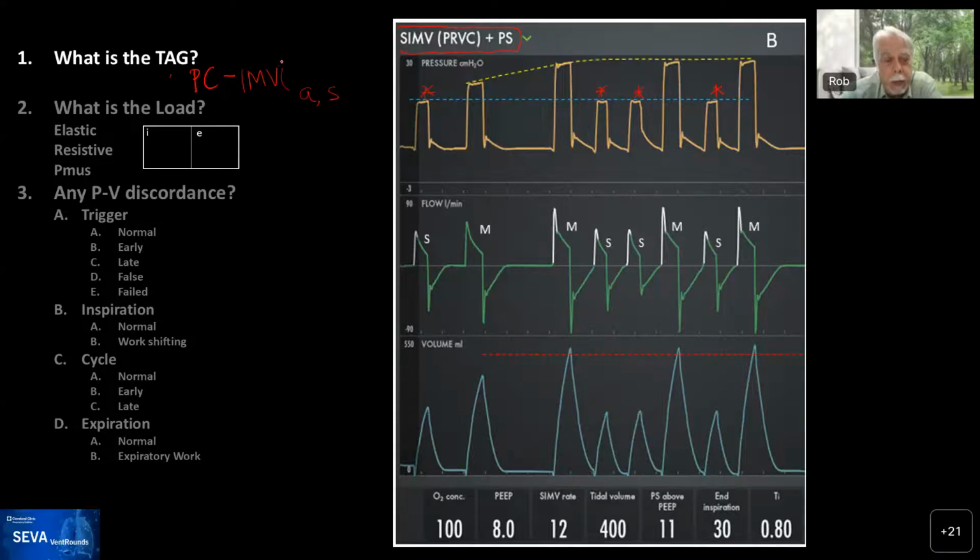So that only leaves us with this idea of more than one kind of IMV, right? Originally, IMV, or sometimes called SIMV, was a mode where you can set the frequency of mandatory breaths, and then spontaneous breaths could occur at any rate they wanted in between, and the two did not interact. Later on, manufacturers realized that mandatory breaths are not that comfortable because you set the inspiratory time and it might not match the patient's neural inspiratory time. So they said, well, if there are spontaneous breaths like we see here, let's just let those suppress the mandatory breaths. And that's called IMV Type 2.